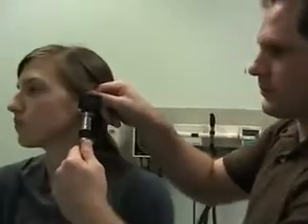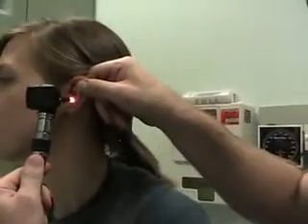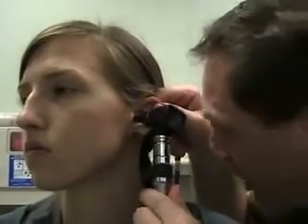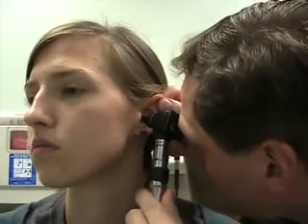As you do it, you put the otoscope toward the front of the ear and press forward. As you slide in, then rotate and look. If you're in the right spot, you should see it without having to go too deep into their ear. If it's hurting the patient, or if you're not seeing anything, then you're doing it wrong — ask the professor for help.